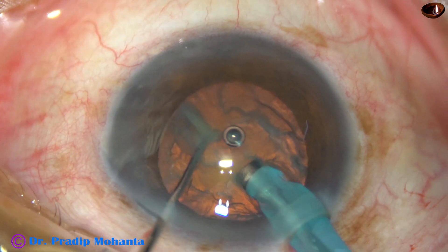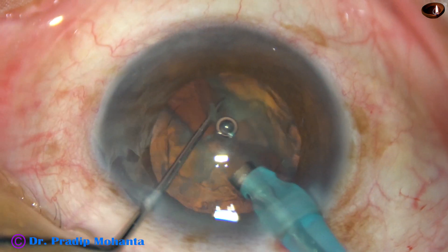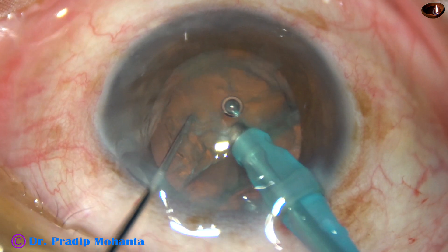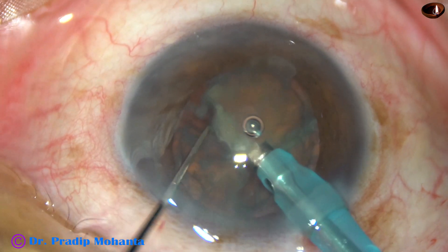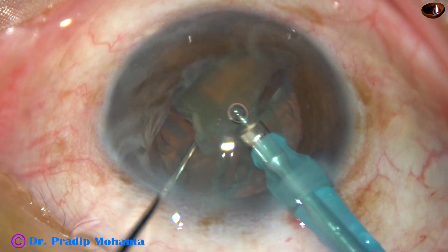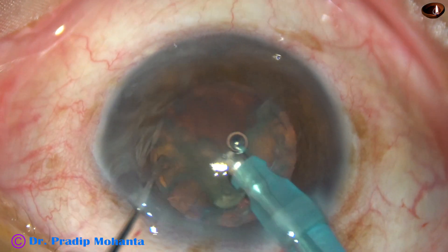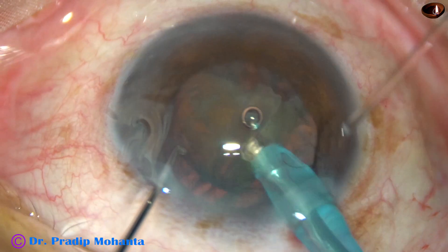The chopper comes to the tip, and when these two instruments are very close to each other, opposite forces are applied and the nucleus divides into two halves. This is known as mechanical chop, because we are not using any vacuum or ultrasound for dividing this nucleus. Now this hemi-nucleus has been divided in the same way — just supported by the phaco needle — and the chopper is used to divide the hemi-nucleus into two.